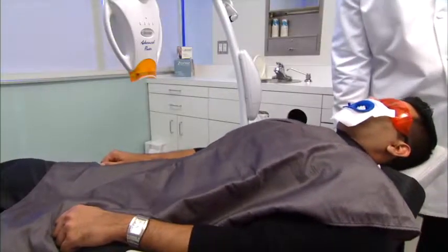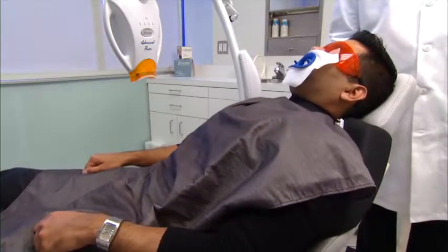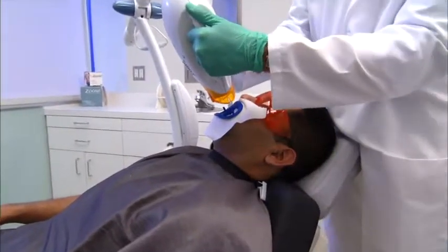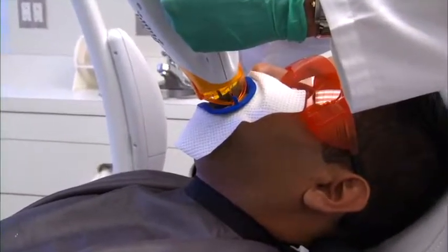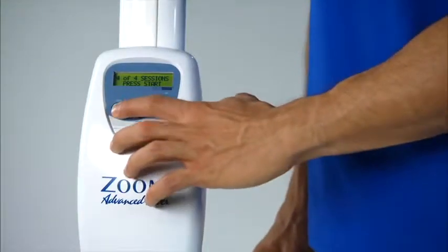Raise the back of the chair so the patient is in a slightly reclined position, about a 45-degree angle. Align the light guide to the IsoPrep retractor. Place the end of the retractor into the slots located on either side of the light guide. Begin the Zoom session by pressing the Start button on the display panel.